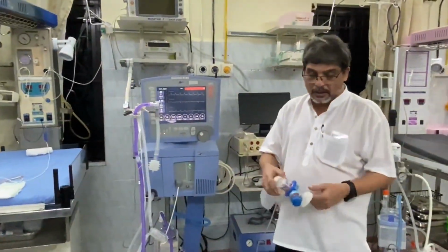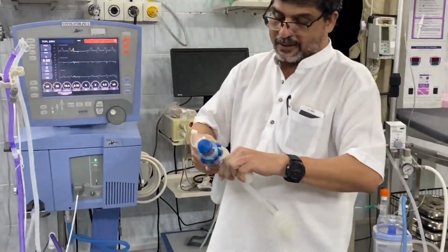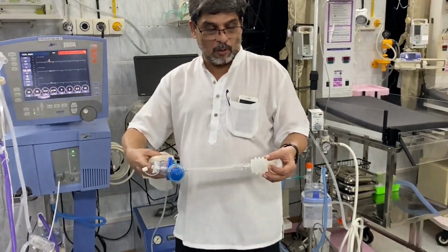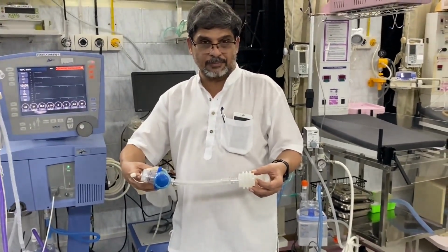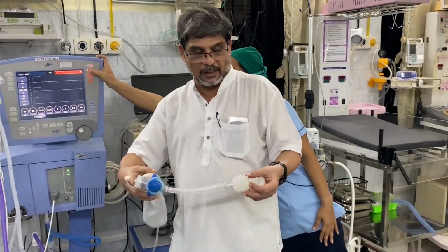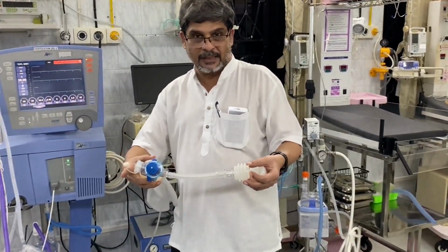It is nothing but a bag and mask. I will repeat again. This is the baby lung. You are ventilating the baby. This is inspiration. When the lung goes back, that is expiration. Inspiration, expiration. If you don't allow it to expire totally, this is called PEEP, positive end-expiratory pressure, whereas this is PIP, peak inspiratory pressure. If you allow it to go back totally, the positive end-expiratory pressure is 0.